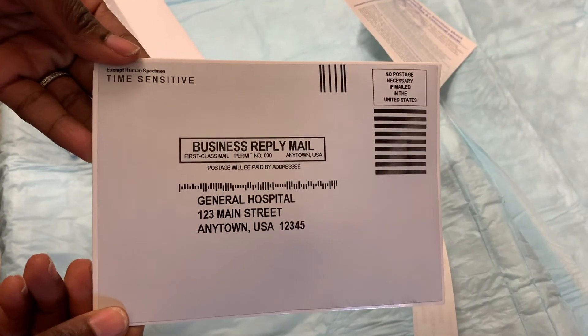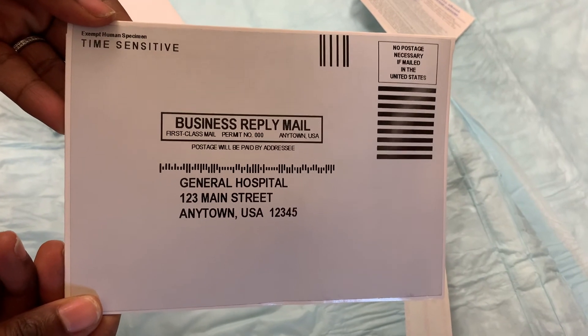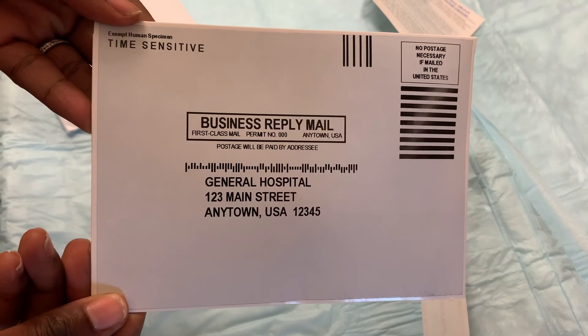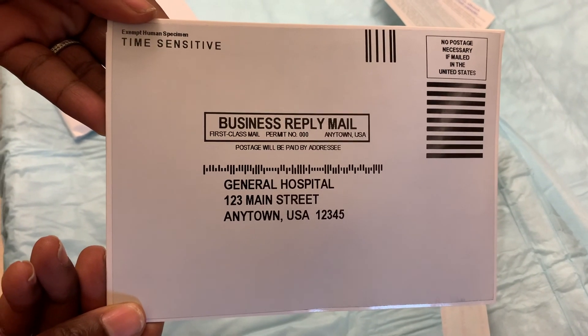And drop this off in the mail within 24 hours of collection. Và đem bao thư này gửi đi trong vòng 24 tiếng đồng hồ. No stamp is needed. Bạn không cần dán tem. Cảm ơn các bạn đã theo dõi. Thank you.